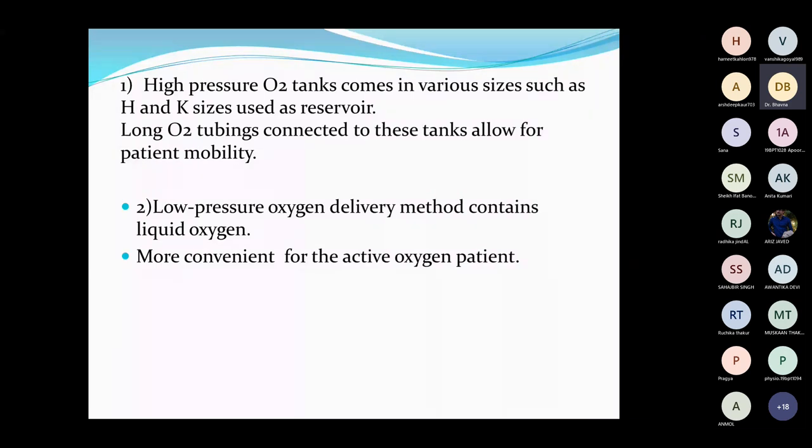Second, the low pressure oxygen delivery method contains liquid oxygen. Remember the content of the oxygen, right? In high pressure, the oxygen is in the gas form, and the low pressure one contains liquid oxygen, which is more convenient for an active patient. One more advantage of liquid oxygen is that it provides humidification to the lungs. It is not dry, right?